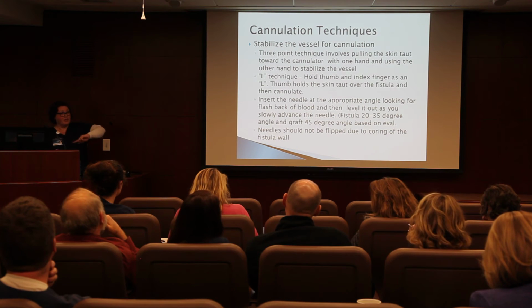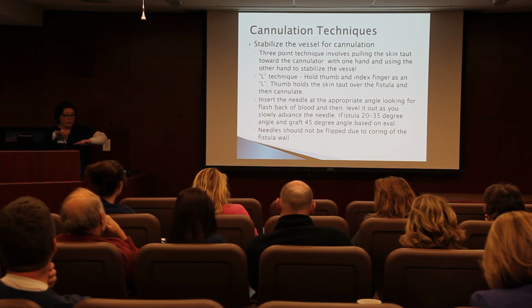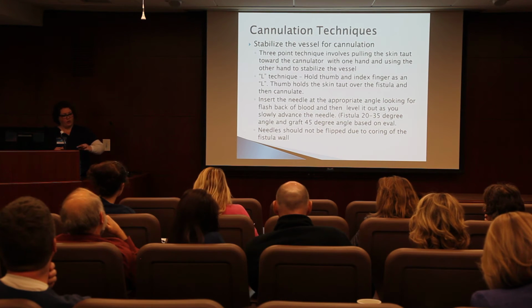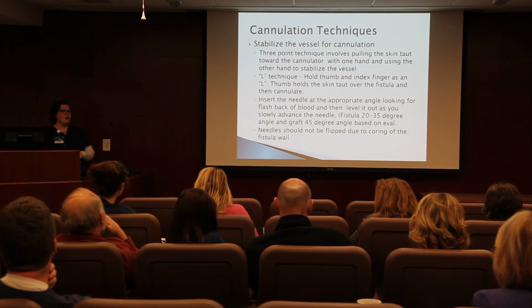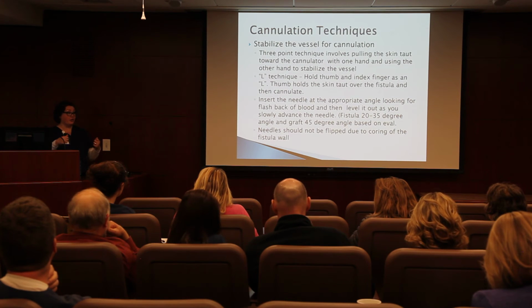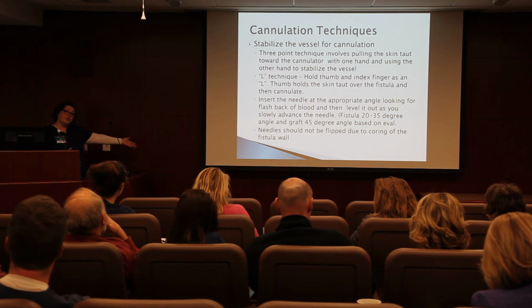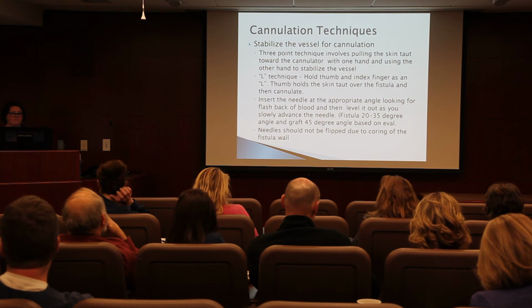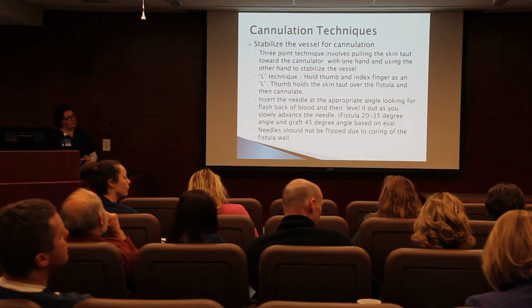Like I said, I like to place my finger along the fistula so I know where it's at when I'm putting my needle in. Sometimes if they're rolly, you do have to hold them between your finger and your thumb and go in. It's kind of just assessing how deep it is, and that's where the tourniquet comes into play too. If you use the tourniquet, it's going to plump it up a little bit more, and truly getting that arm out and hyperextending that elbow will work. And if we're going in, we're always going to needle.